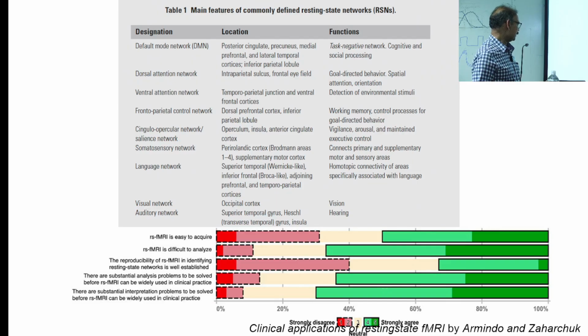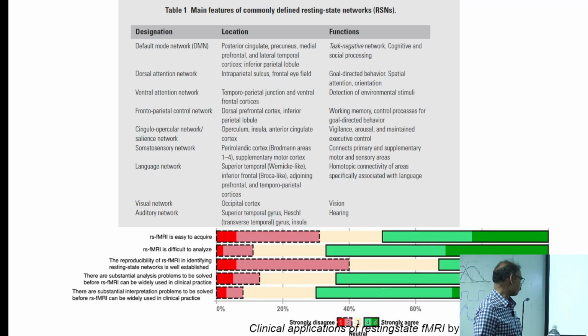Actually, this is what I was very surprised by. Resting state is difficult to analyze: more than half agreed, like how we analyze and what question to ask. Some of the other questions they agreed on too. So the point is there is still some work to be done to make this technique useful in clinics.